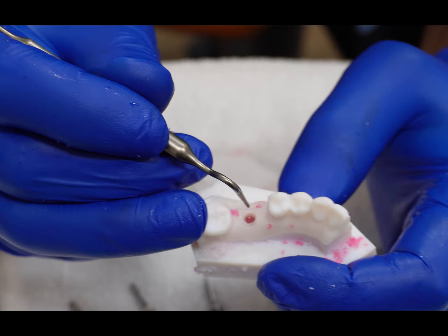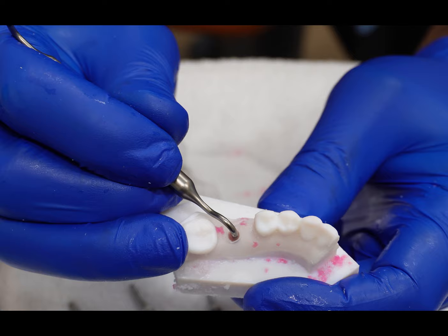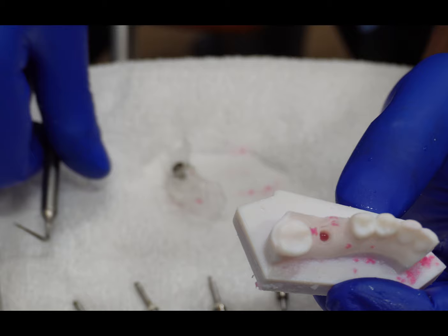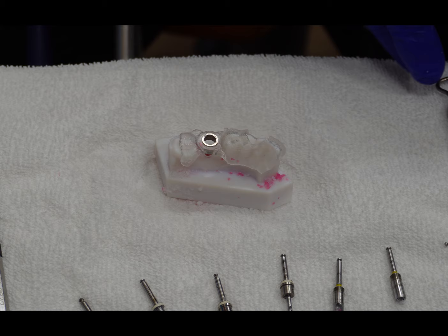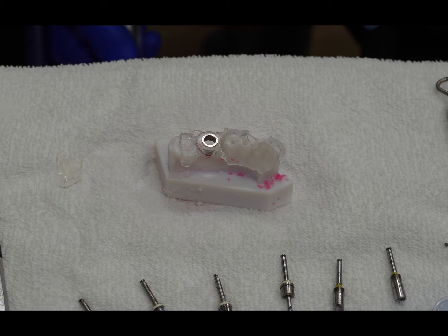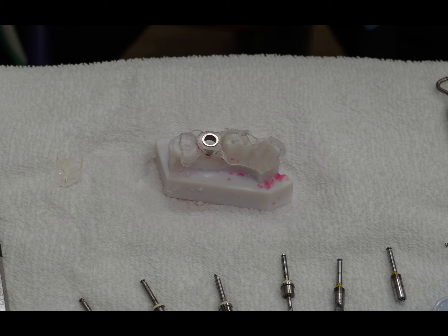Going down to the depth of the implant, the perio probe will have pre-arranged measurements — we're placing the 13mm implant minus the size of the gingival tissue. So approximating from that perspective can be helpful. If, for example, you have a case where you only have 1mm of gingiva thickness because that's the patient's phenotype, you might want to place this implant subcrestally by 2mm to make up for that. You may need to take the guide off and hand drill a little deeper, or in your pre-planning you would plan the implant to be placed subcrestally — but it's also a decision you can make at time of treatment. It's important to take those measurements.